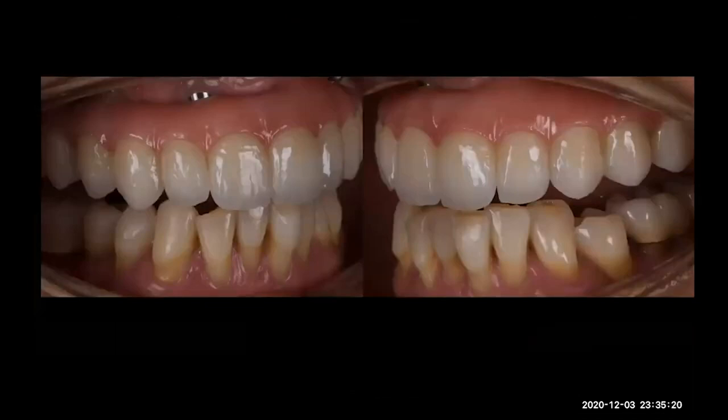Using 95% monolithic crown and a little bit of ceramic in the incisal, lingual incisal portion. Okay, but the important tip here is you need to use the same colors with ceramic that you use in stains, so you can create movement.